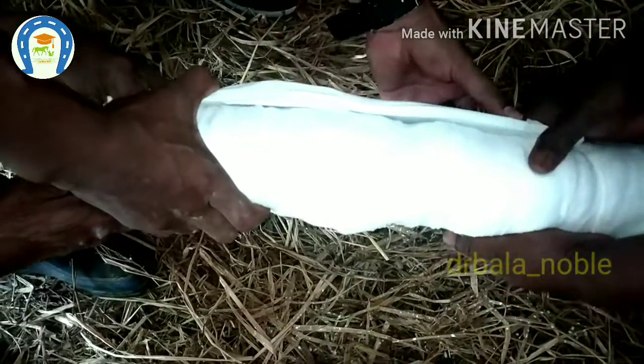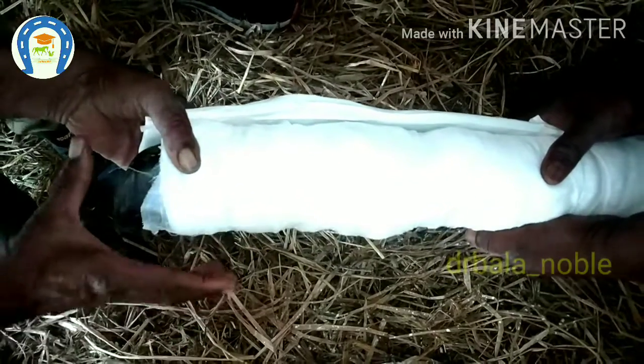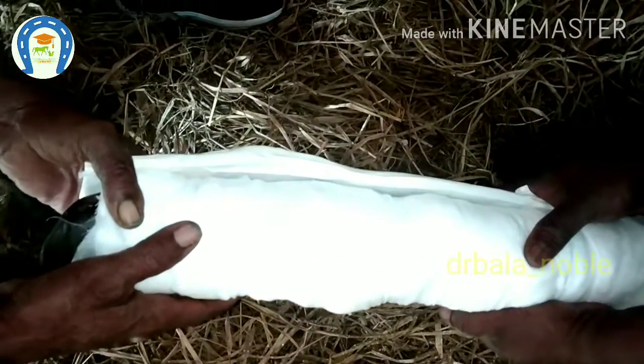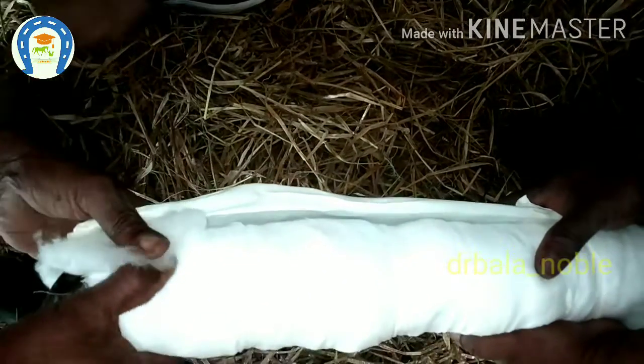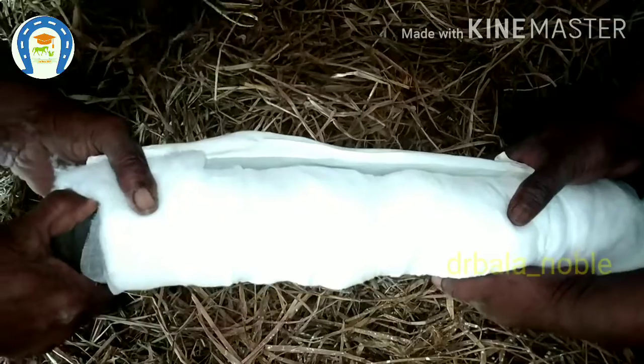Placing the splint at the correct level is very very important. The foal or the animal should bear the weight on the splint, so it should be placed at the hoof level.